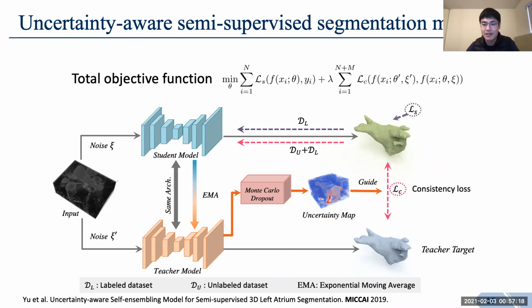I think this is also a very good point of view. For the segmentation, we can see what is the ground truth, or we can see where the network is good at. But for some diagnosis, for example, detecting some disease from the image, actually we want to find the biomarkers, but it is difficult to understand why the deep learning makes such a prediction, or what biomarkers the deep learning relied on.